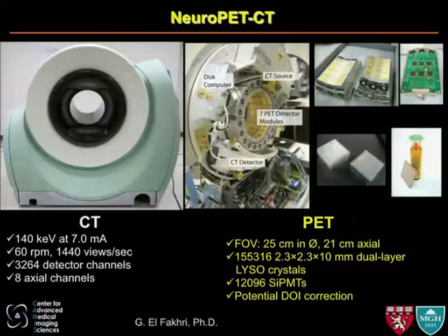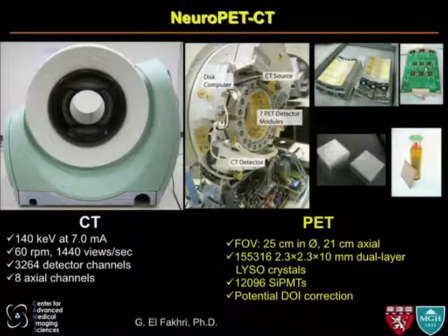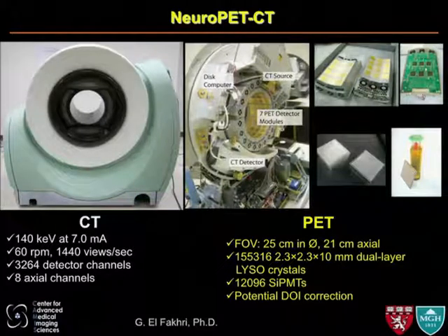And finally, one of my last slides, I think it is the last slide, PET, I think, is going to be coming back on the table. No matter what we do with MRI, NIRS, and our EEG and MEG systems, they're non-specific. And treatments are molecularly based.